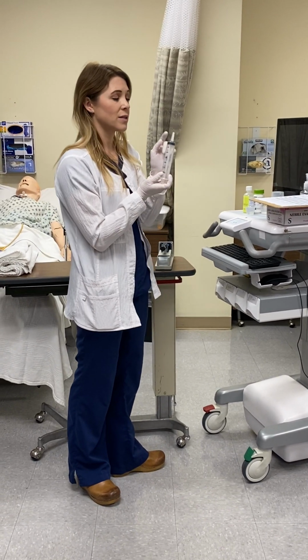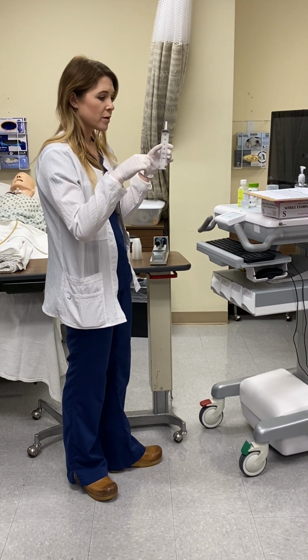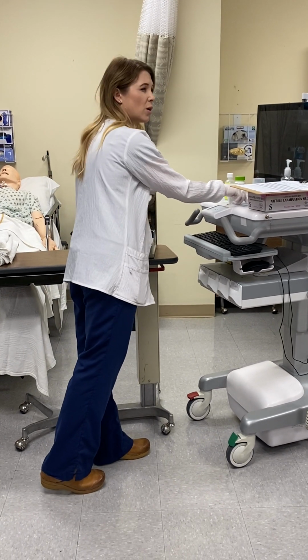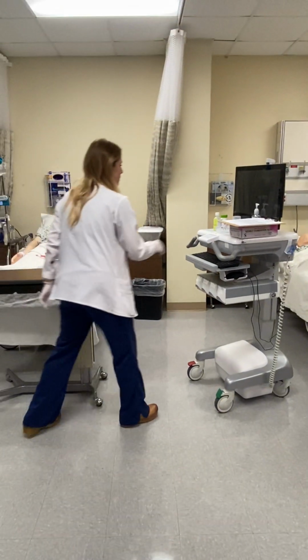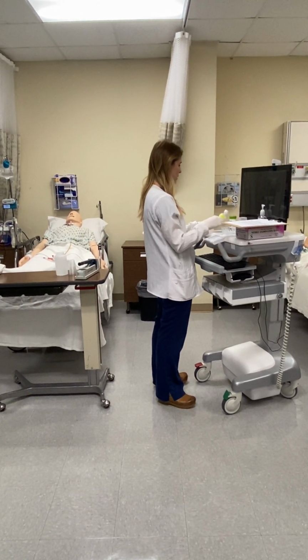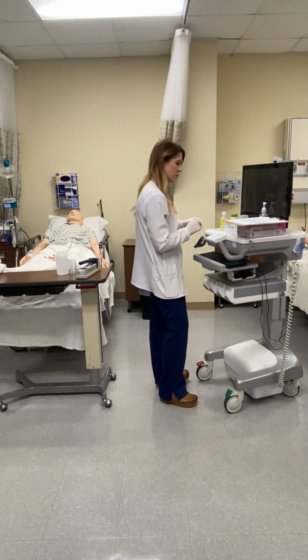If I did not want to use this and wanted a better way, I could use one of those sponge toothettes, the back side of it or something like that, to stir it up. A straw, I don't know, something simple. Okay, so now I'm done with my second check. I've got my 1 milligram of folic acid crushed up in here with 10 mLs of water, my 30 mLs of multivitamin for Mr. John Smith, and we're going into room 2.